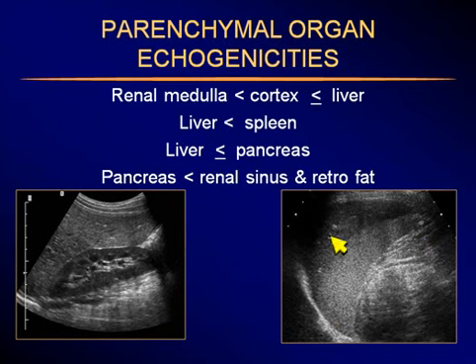However, we also note that there are some little vessels in this part of the spleen, not so much seen here. And then we realize that this is liver. This is the left lobe of the liver going all the way across to the left, hugging the spleen, so that it looks like it's a part of the spleen, and it isn't. So this is liver, which is indeed less echogenic than spleen. And this is not to be mistaken for a subcapsular hematoma. Sometimes this is mistaken in the spleen. So there's our proof.